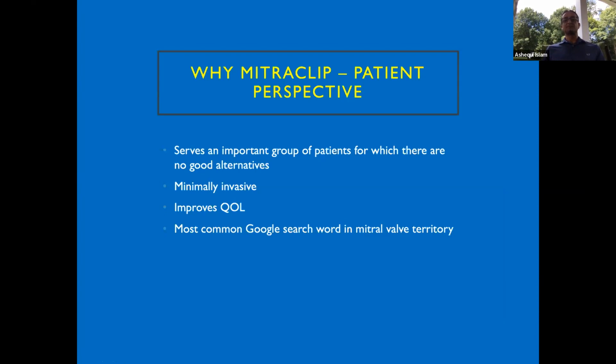Why is mitral clip good for patients, or why is it important? It serves an important group of patients for which there are no good alternatives. It is minimally invasive, by the way. It's not a high-risk procedure. It sounds high risk because it's a complex valve, but it's less risky, in my opinion, than doing TAVRs.